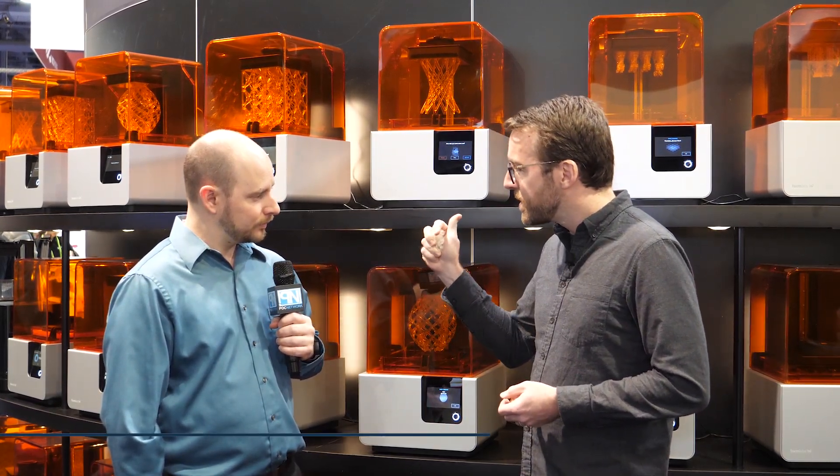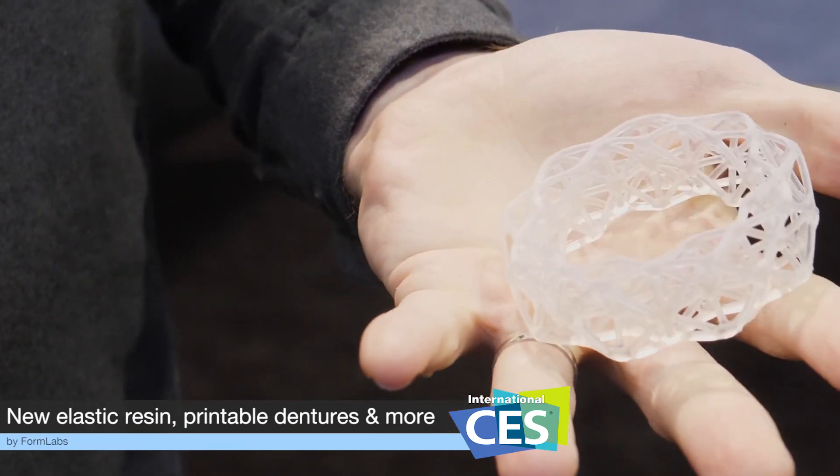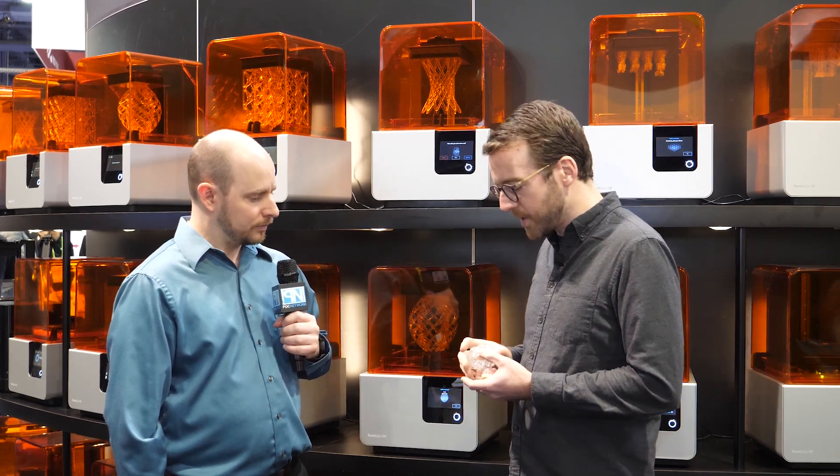One new material is this elastic resin. It's very soft, springs right back, and it's very durable. It fills a need — this is a type of performance that hasn't been achievable on an accessible 3D printer like this. It's similar to a silicone; it's in the family of methacrylates, just like the rest of their materials, but it performs a lot like silicone.